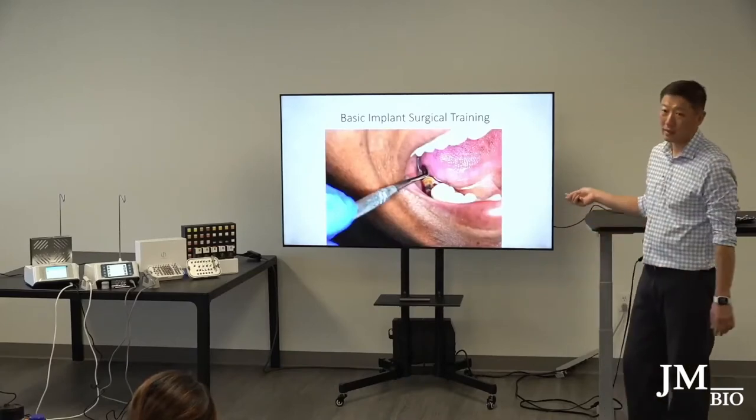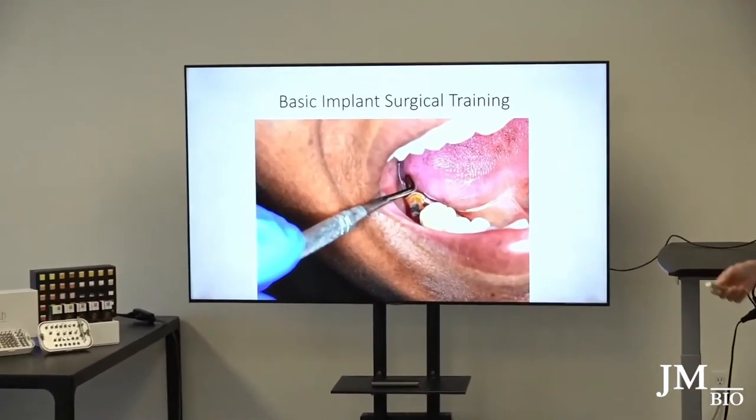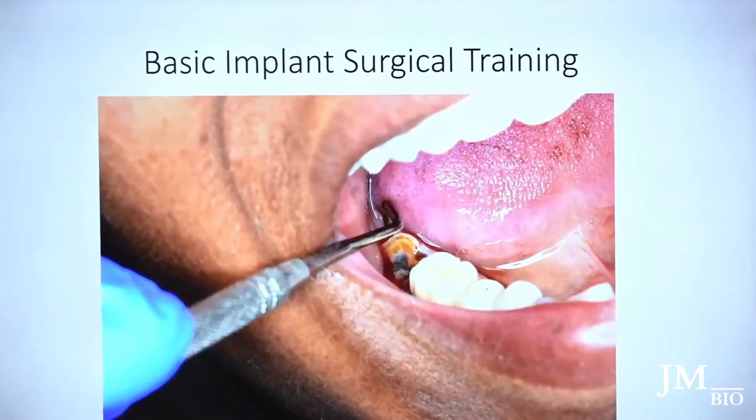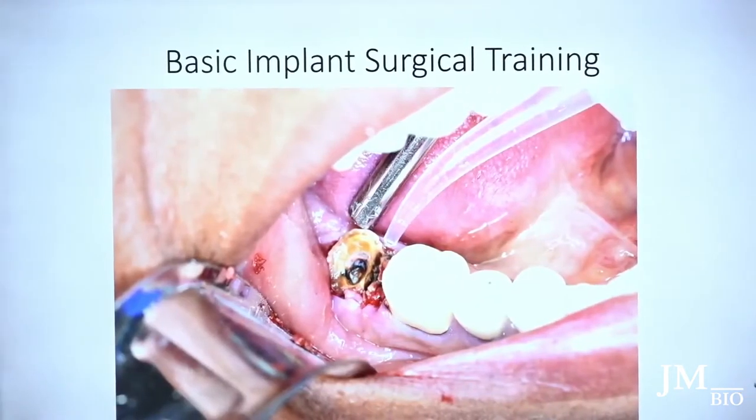I love using the Orban knife — that's one of my preferences. Everybody has their own preferences. I go around the tissue to separate it from the tooth, then split the tooth. Whatever you need to do to take the tooth out as atraumatically as possible. I haven't laid a flap — I'm just going around the tooth and separating the bone and gums.